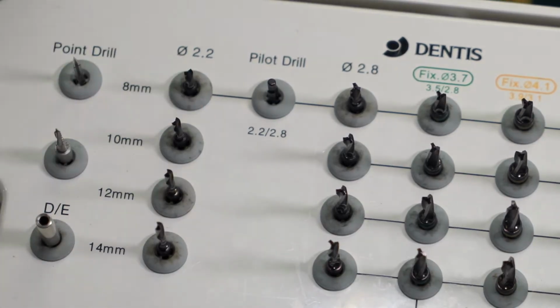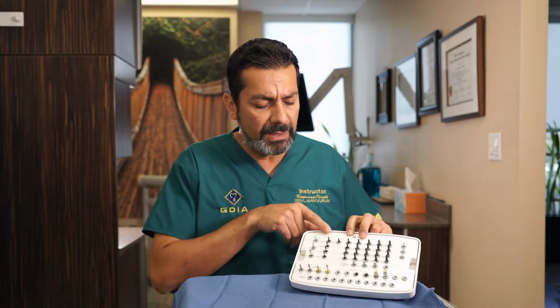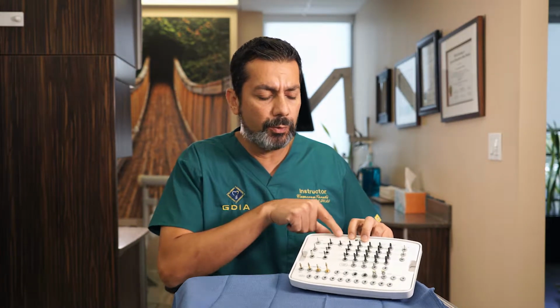The pilot drill is also a drill that I personally seldom ever use. It's something that goes between your 2.2 and your 2.8 drill, and again, that is just to widen up your osteotomy. I seldom ever use it.